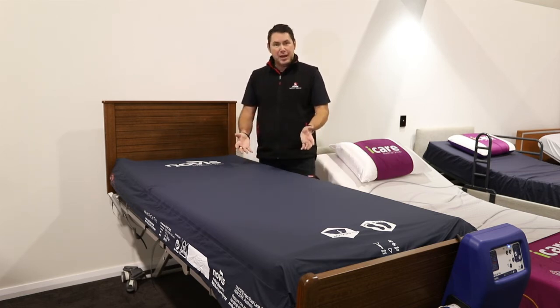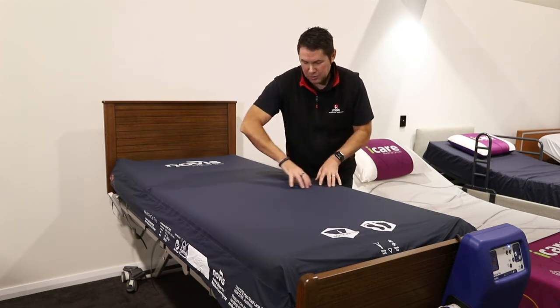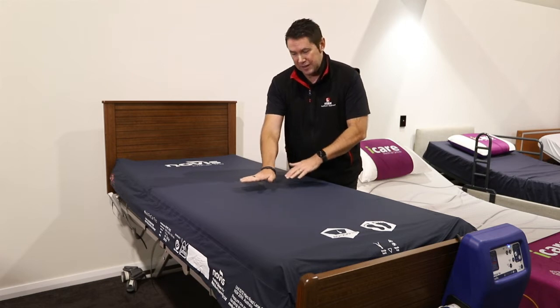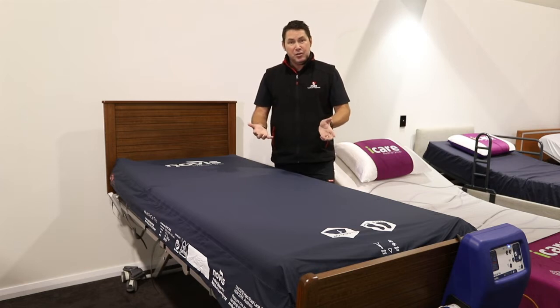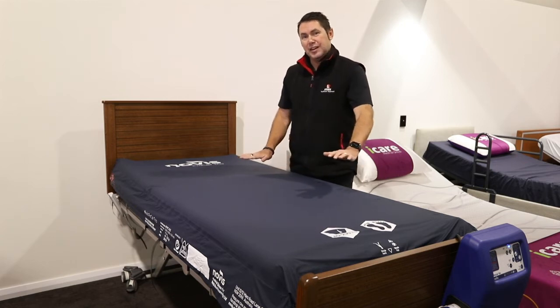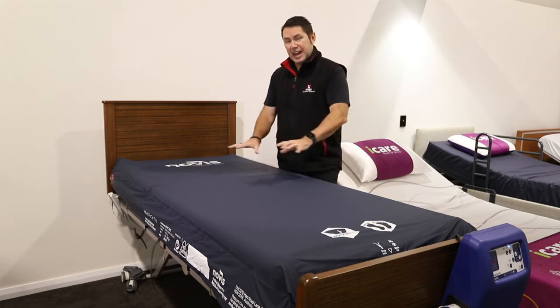So when we typically talk about an alternating air mattress, what do we mean? Typically the mattresses that we use, like in our hire fleet, have a range of cells that come across this way, or bladders if you like. With an alternating air mattress, one of those is fully inflated, the next one is slightly deflated, and so on the whole way down the bed. So if you've got someone lying on the bed with some sort of pressure injury, they're not going to be exposed to that full pressure at any one point because it constantly changes. That means 50% of the person is supported in their weight at any one time in the mattress.